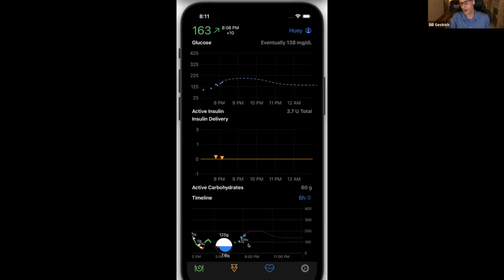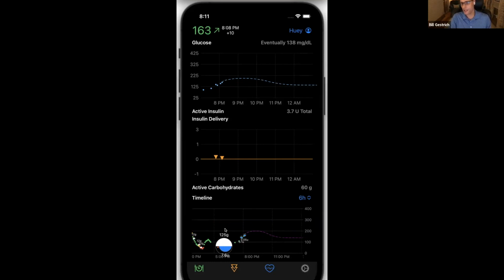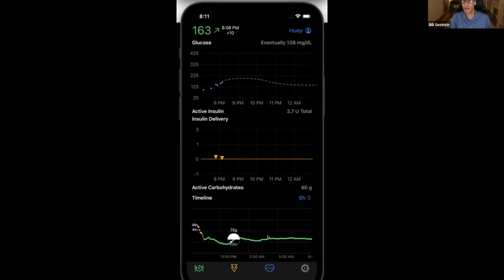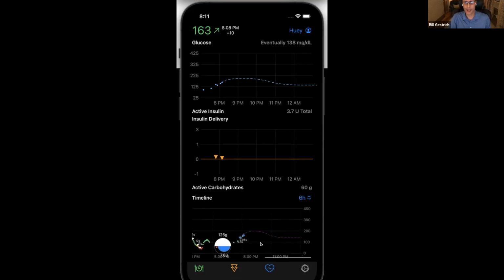And then later on, we brought in the loop graphs. That's why there's a difference between that one and the bottom and the other ones. This one was one of the first parts of Caregiver before the additions there. So with the Night Scout like interface, this timeline, you can scroll backwards up to 24 hours in the past currently. Someday we may increase that to a couple days. There are some issues with caching where we need to do some performance optimizations before that would work. But right now you could go back a day.